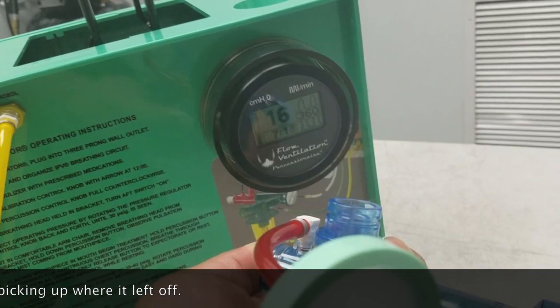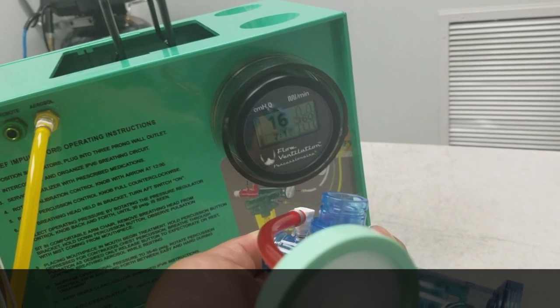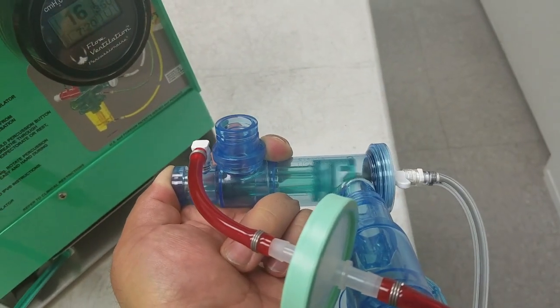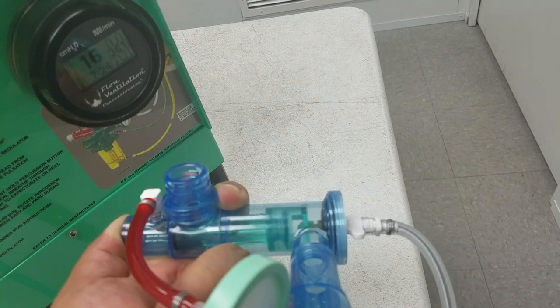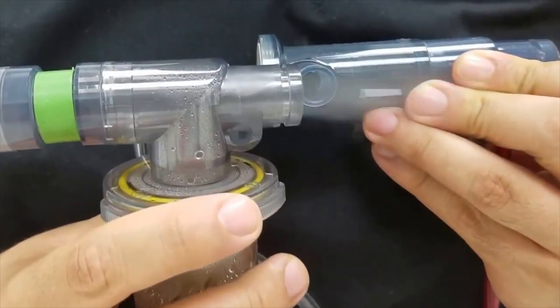So the variation there — by just going down a few PSI — you are going to have a change in pressure and rate. We don't necessarily have a ton of direct control over the pressure when using the Impulsator, but indirectly you do have some control by manipulating the operating pressure or PSI.